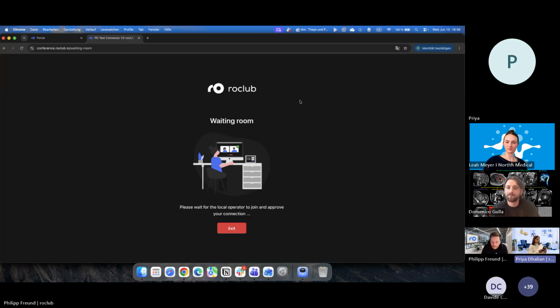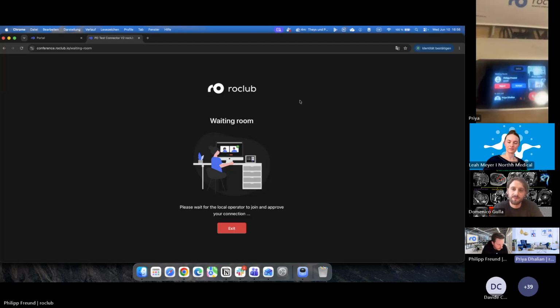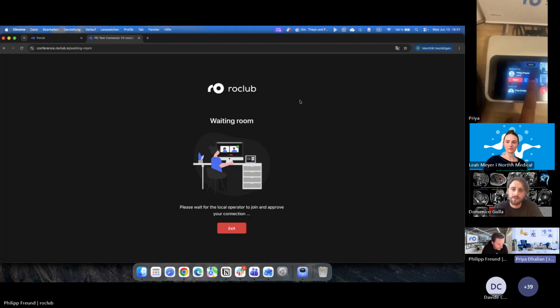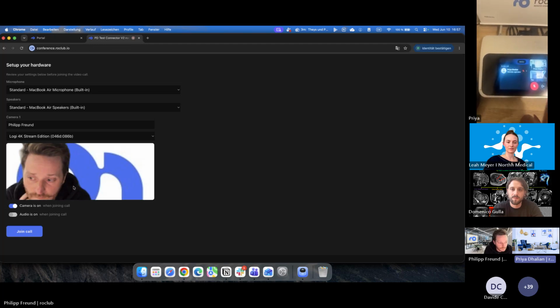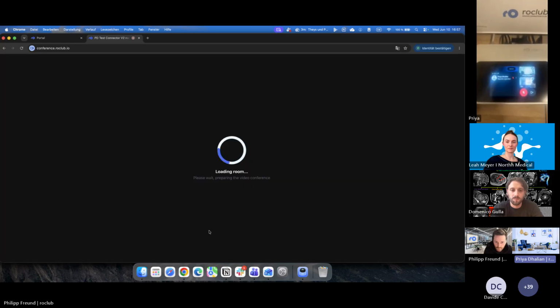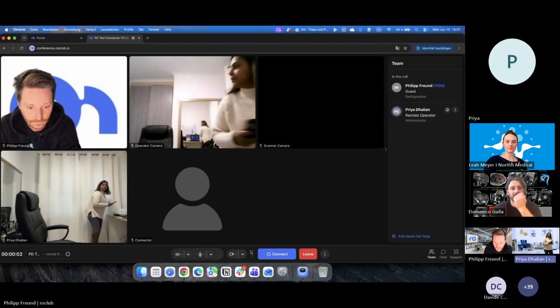Okay, so he's in the waiting room, and on my side, there's a message once again on the connector that there is a participant wanting to join. So the radiographer will say accept. Now we are in a video conference mode. So your radiographer can communicate with your application specialist. She or he can also communicate with other guests wanting to join and learn as well. Philip can go ahead on that side.